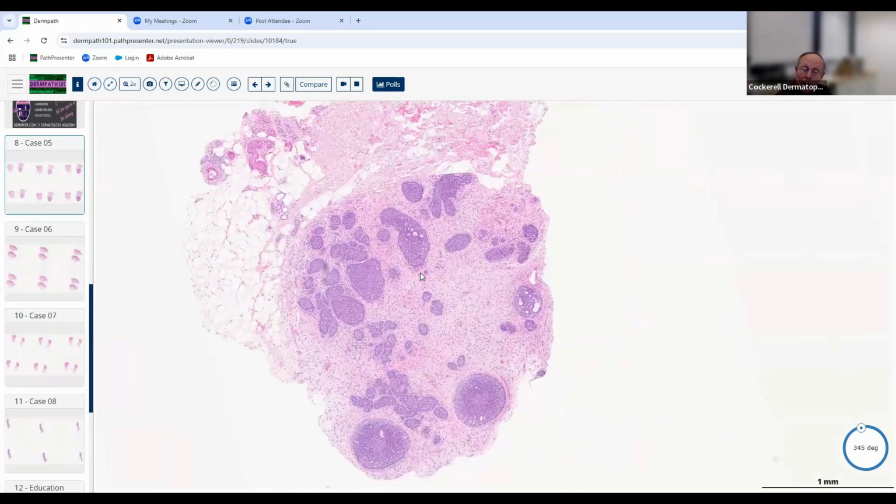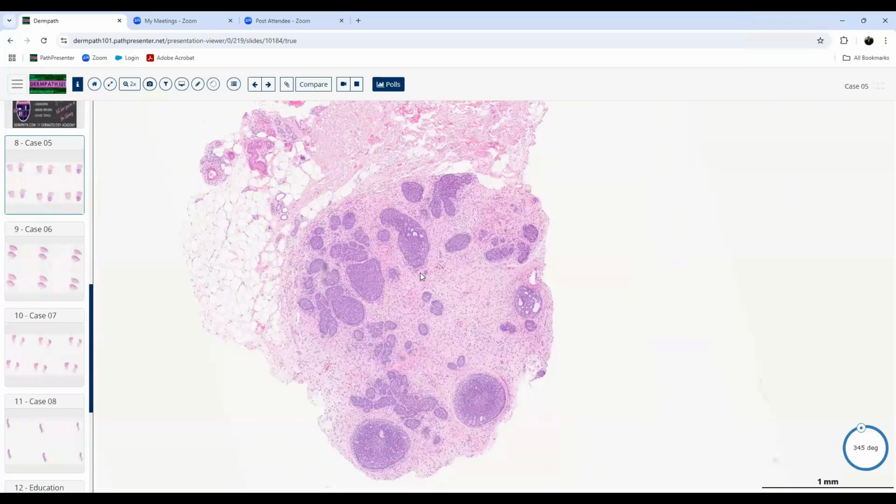But as a general rule, what I was pointing out to you earlier is when you're looking at the benign epithelial follicular lesions, stroma tends to predominate at least somewhat over the epithelial component. The stroma is part and parcel of the soil-seed component of that lesion. When you're looking at a basal cell carcinoma, for example, by far the majority is epithelial.